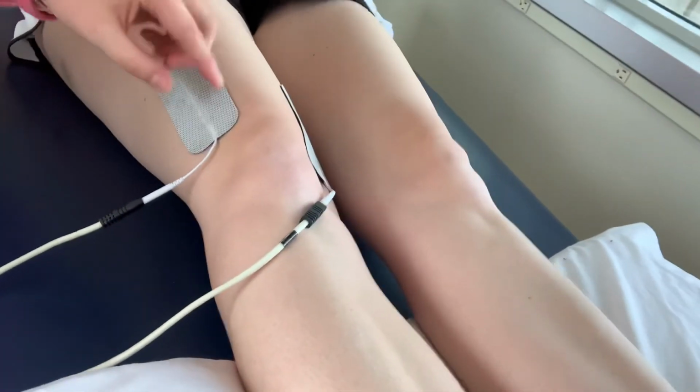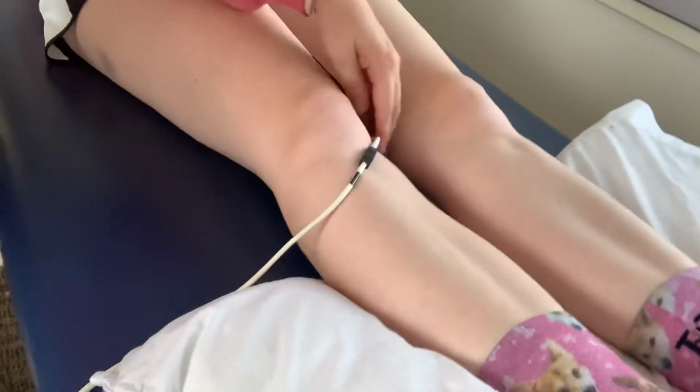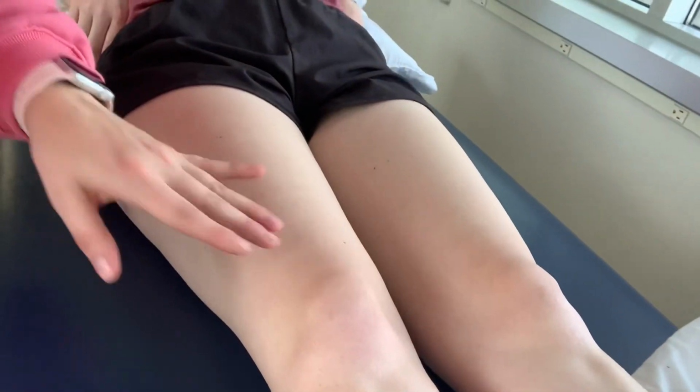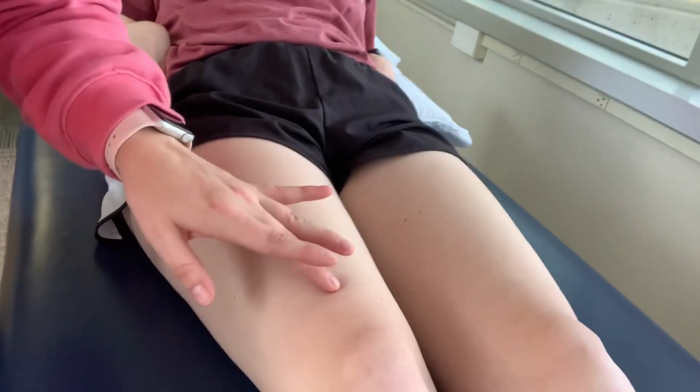Okay, so I'm going to go ahead and remove these pads. Okay, and any discomfort or anything in this area? Nope. Here? Okay, and skin looks good, no burns or anything are visible. So thank you so much.